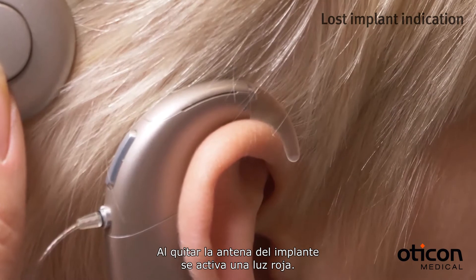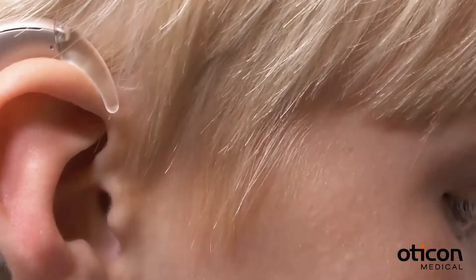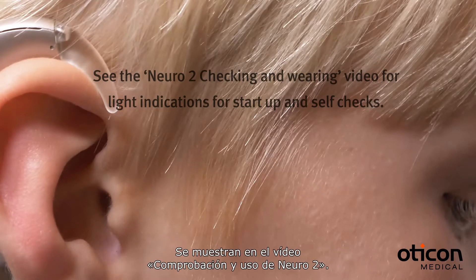Removing the antenna from the implant triggers a red light. There are also light indications related to sound processor startup and self-checks. These are shown in the Checking and Wearing Neuro 2 video.